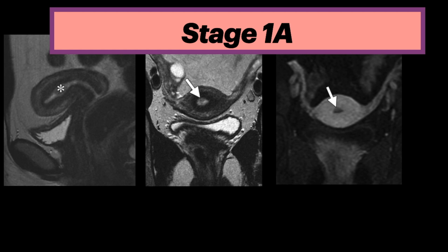This is an example of stage 1a endometrial cancer. Sagittal T2-weighted MRI shows distension of the endometrial cavity by an intermediate signal intensity tumor. The axial oblique T2-weighted MRI shows the intermediate signal intensity tumor within the hyperintense endometrial cavity, with the junctional zone still well delineated and no evidence of invasion.